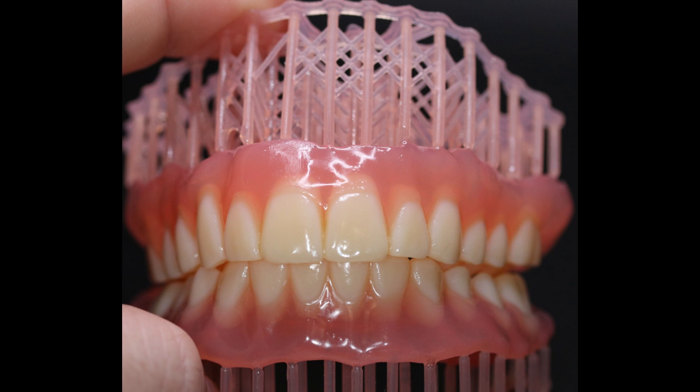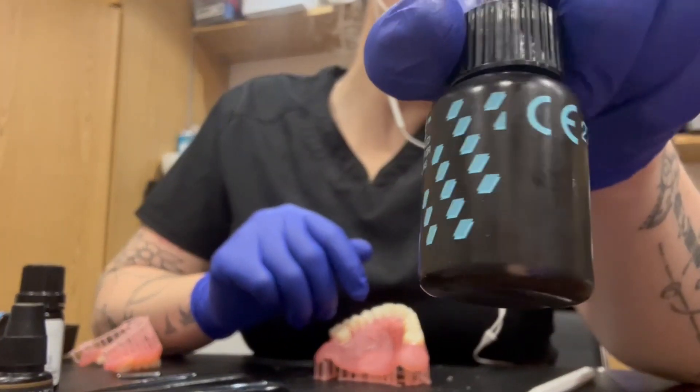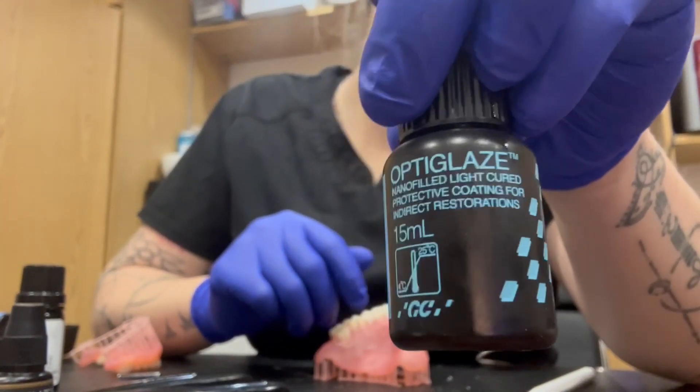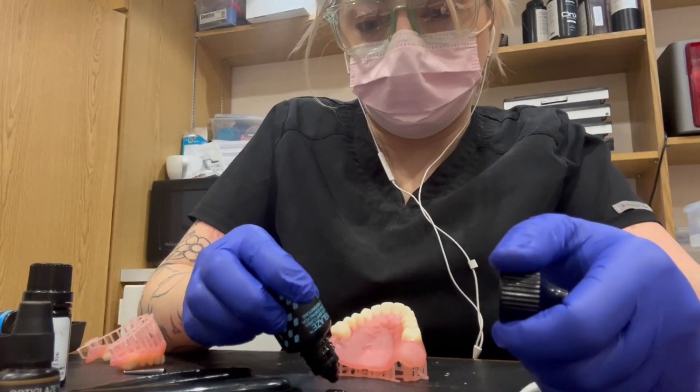First thing you need to know is I use the OptiGlaze kit, which is great for all 3D prints. We use mainly just a few colors but I do love having them all available. We just buy the bigger bottle in bulk — really great.